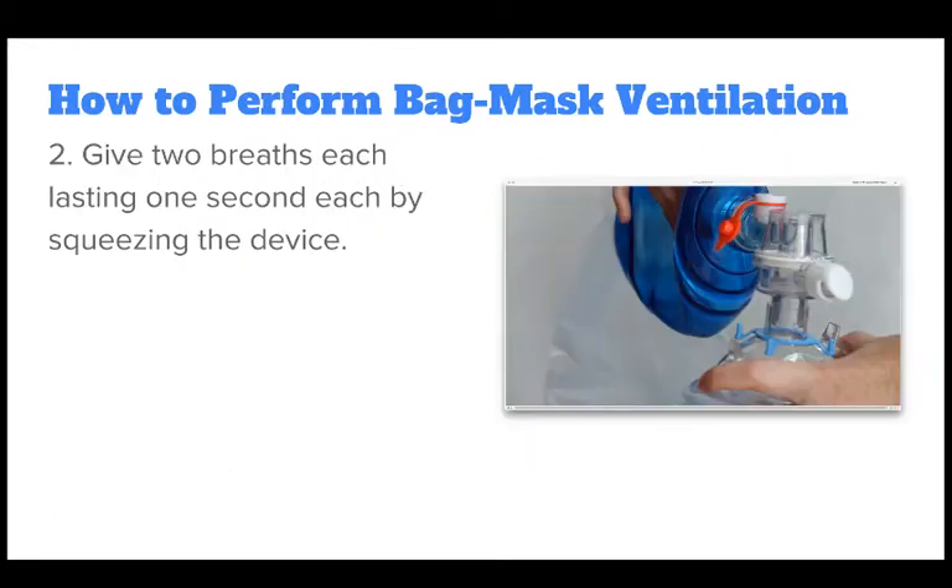Deliver two breaths lasting one second each by squeezing the device. Watch for chest rise to ensure your breath was administered correctly. If you don't see chest rise, you can try putting the airway back in neutral and then reopening it and giving the breaths again. Spend no longer than 10 seconds before resuming chest compressions.